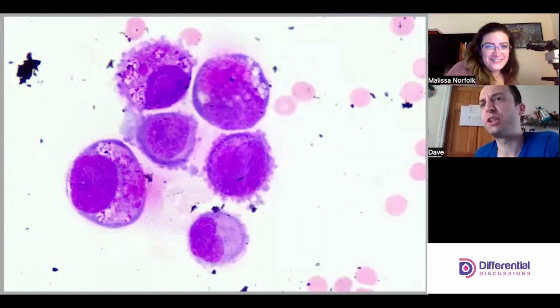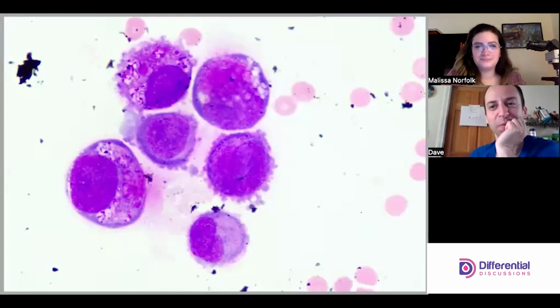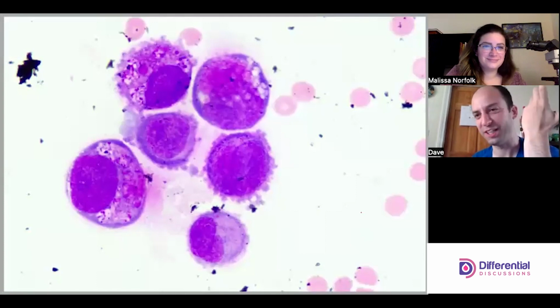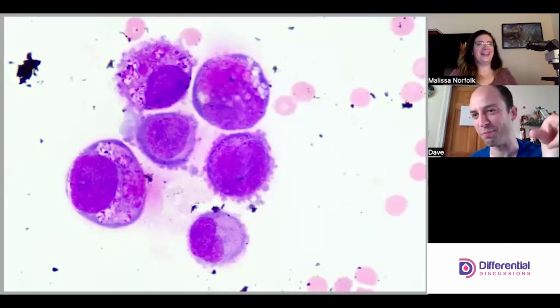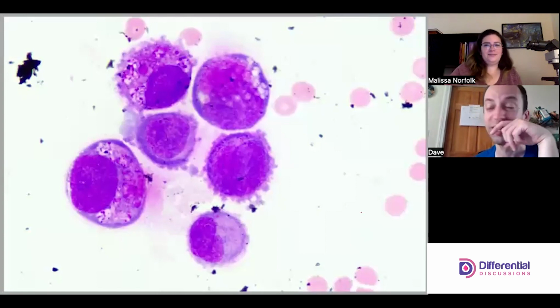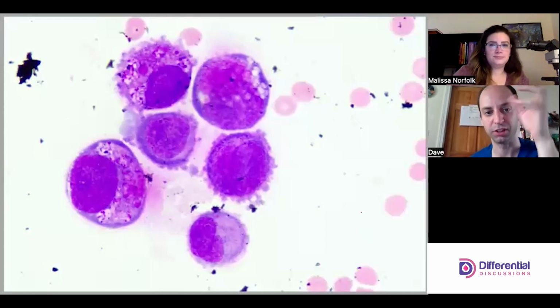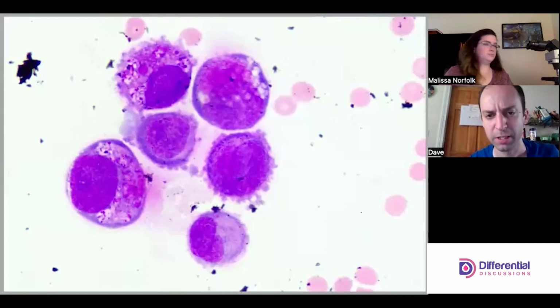You can also get strange granules in cells that shouldn't have them. We talk about automation in our field and that we're not going to have jobs. Just trust me for now, ChatGPT can't do anything about what's going on here. It's woefully inadequate. But excellent observation of those chromatic granules there.